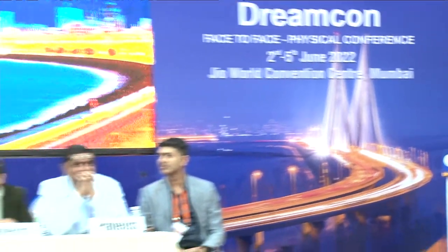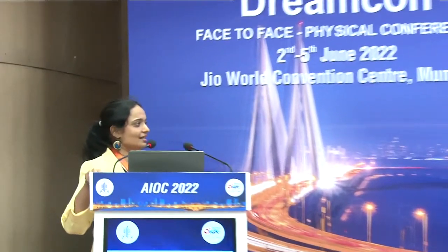Whatever points he has made are 2 to 3 years old. This was an article in 2022. But one article you can't show and say this was the total. Okay, no problem. But yeah, the projection artifacts, segmentation problems, these are 2-3 years old questions. They have all been sufficiently answered by projection resolving and segmentation, which takes only 10 seconds if you make a section of 15-20 microns from the ILM to the Bruch's membrane.